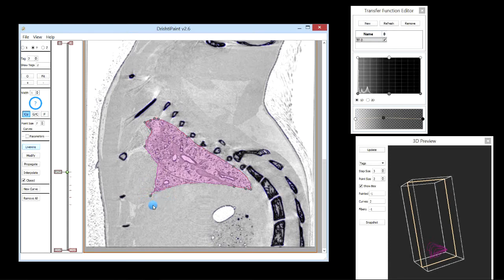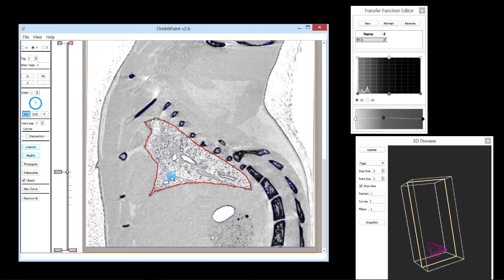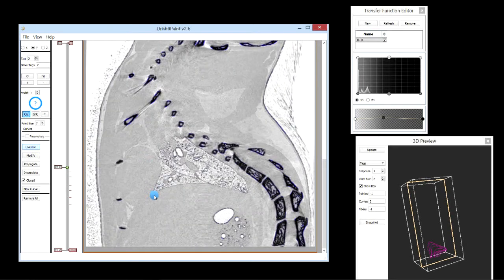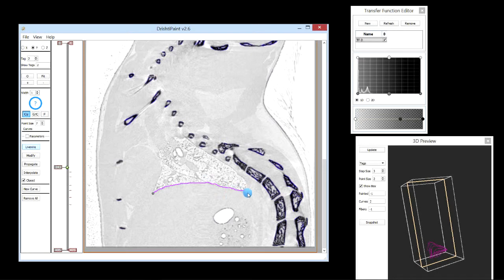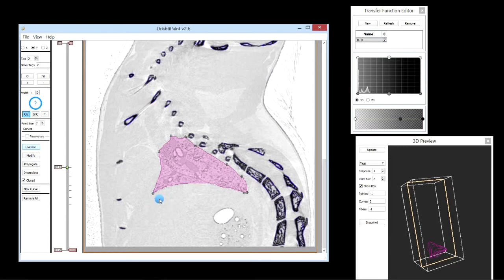Again, spacebar will close that live wire. Here I would like the live wire to go from here to here, so I will just modify that live wire and move this point. I can also add seeds or anchors and remove them. From time to time you may have to change the transfer function if your data changes in intensity — if there are intensity variations, you might have to tweak the transfer function to increase the contrast.